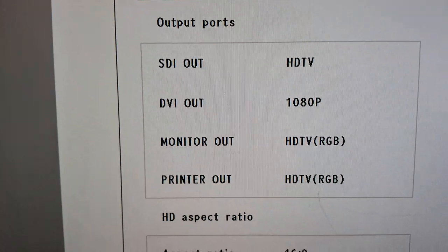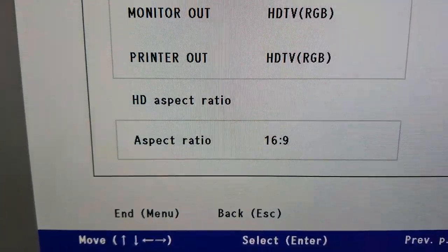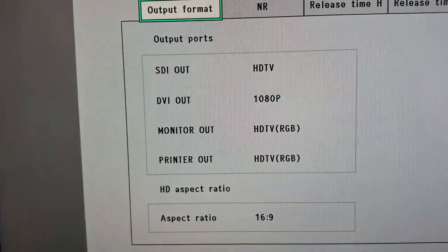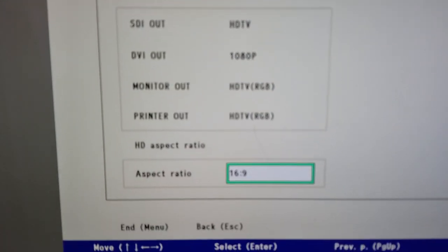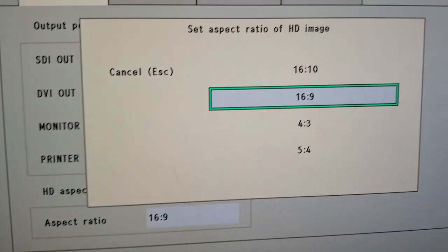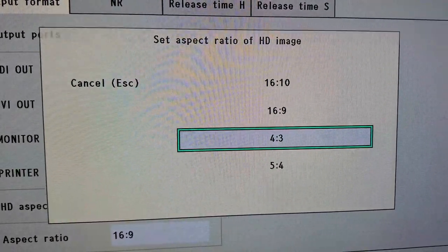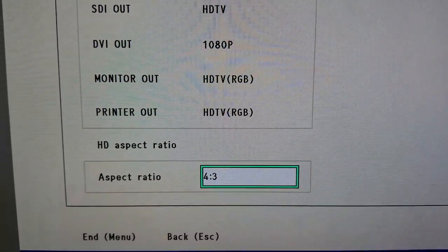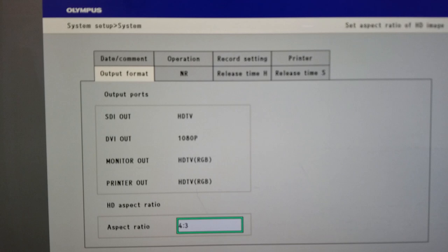You are greeted with this selection, and look down here — Aspect Ratio: 16 by 9. There is the problem. Scroll down, hit Enter, go down one, and select 4 by 3. Now we have 4 by 3 set in this system menu.